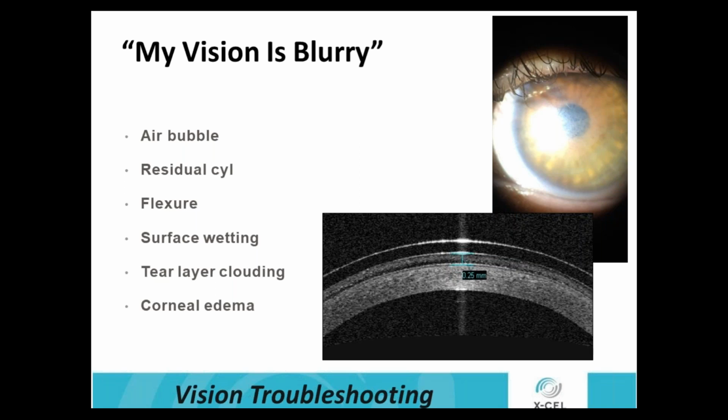And we can find out through a slit lamp evaluation, and even through an OCT, we can see the buildup behind the lens in an OCT. So if you see that clearance and you see all this buildup, and they're not getting their best corrected visual acuity or what you did on the initial fit, then we know that we've got to make some changes. Do we reduce that central clearance? Is it because we have too much limbal clearance? And then I'll go back to the patient.